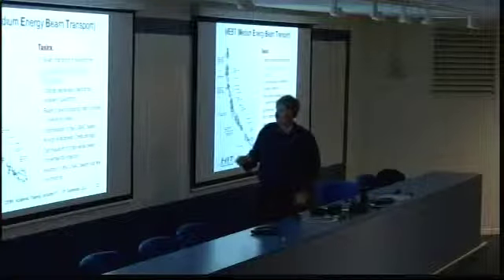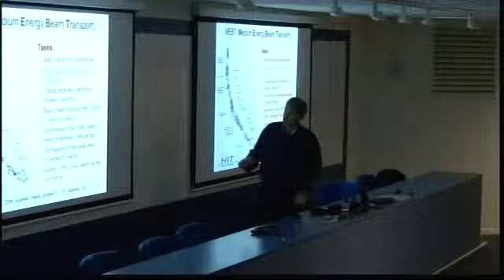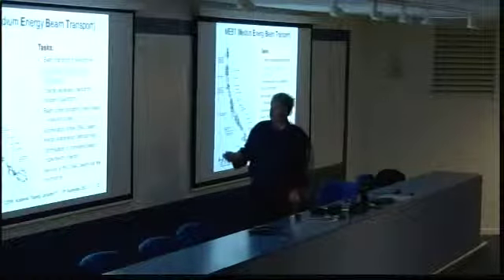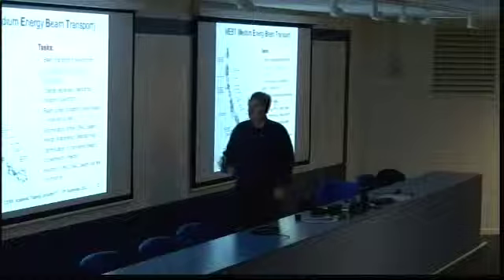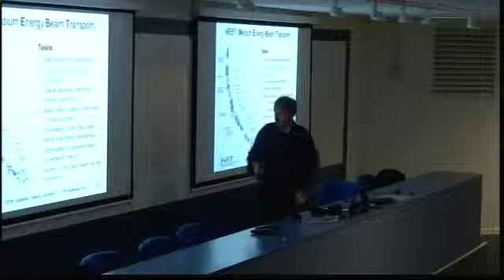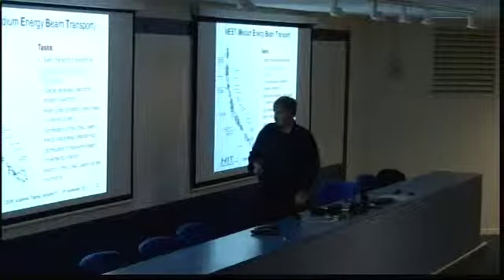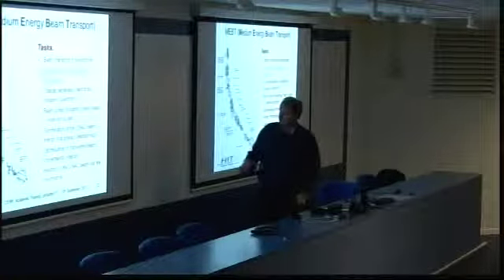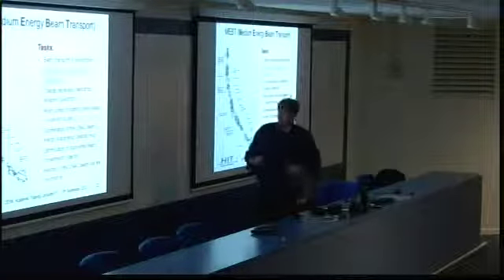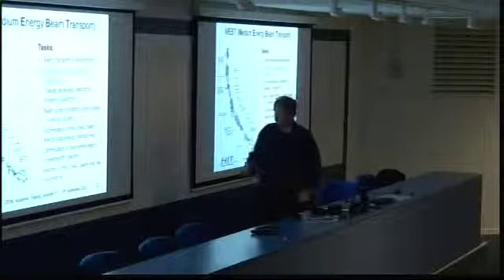We will come to that. Again, we have a second chopper here, which is a little bit of luxury, but we can then shape again a little bit the beam for the injection to the synchrotron. Well, and at the end we have also a debuncher to optimize the linac beam energy sharpness to the synchrotron injection.